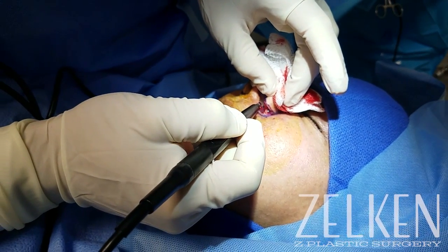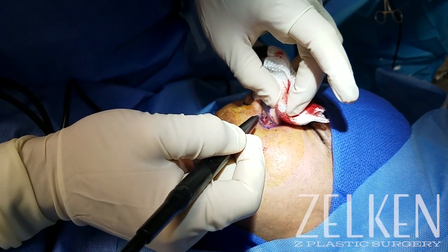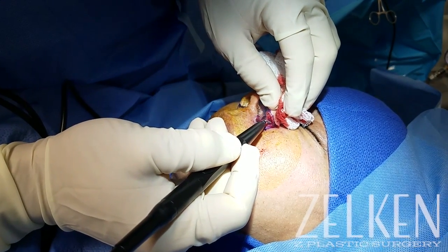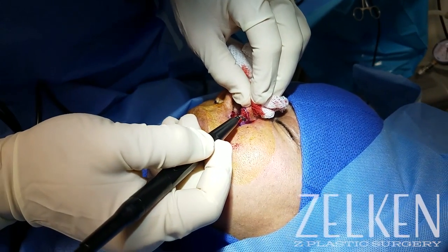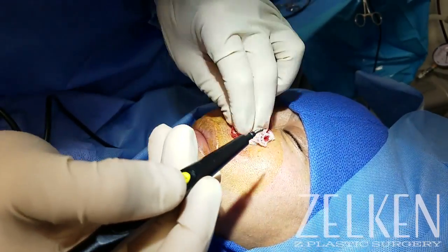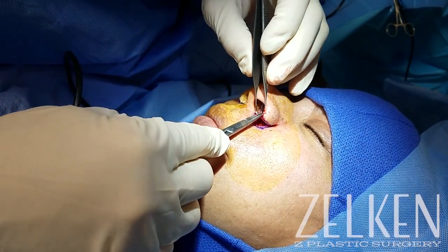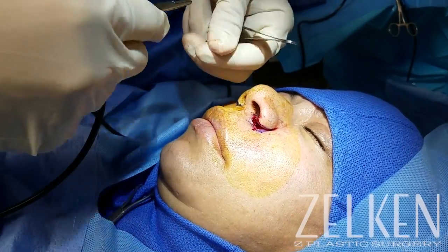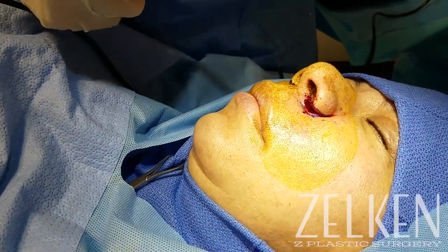Some people talk about avoidance of using monopolar electrocautery. I absolutely think it's fine to do, but I use a needle tip and I use 15/15 cutting and coagulation current. I do make every effort to make sure that the wound is absolutely dry. However, I do stay clear of the dermal edges, as in this Latina patient there is a propensity for hyperpigmented scarring. My objective is to create as natural and invisible a scar as possible, and placement of the scars in very strategic positions is important, but it's also important to make sure that the patient has achieved excellent hemostasis throughout the procedure.